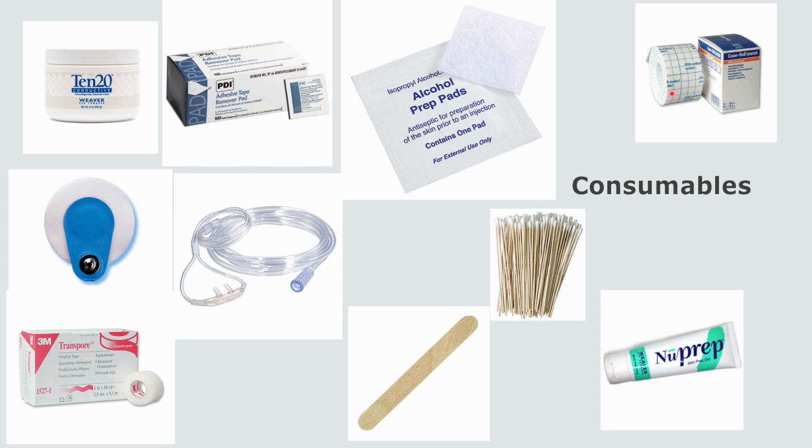Cover roll tape is very popular, and it's great for everything you need on a patient's skin. It comes out long and thick so that you can cut out the size that you want, like small for the face or giant for the leg EMGs.